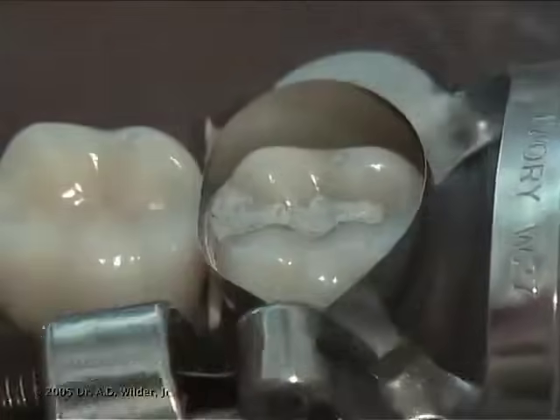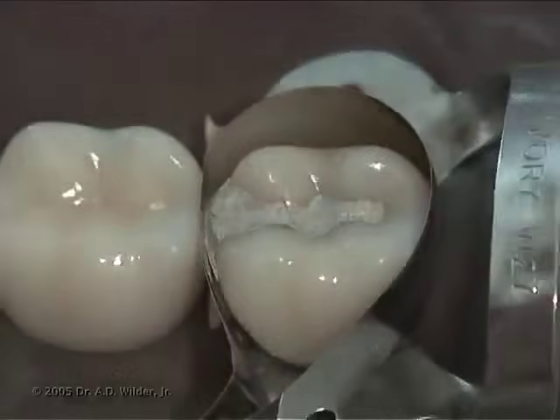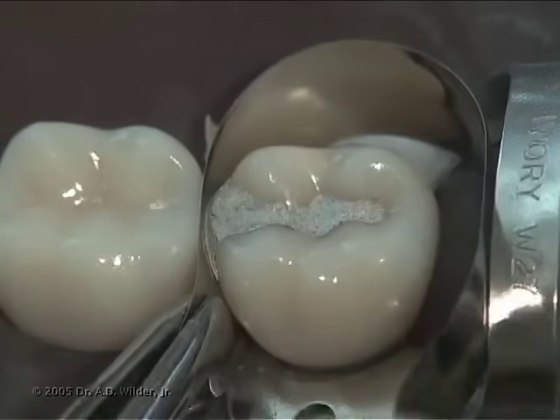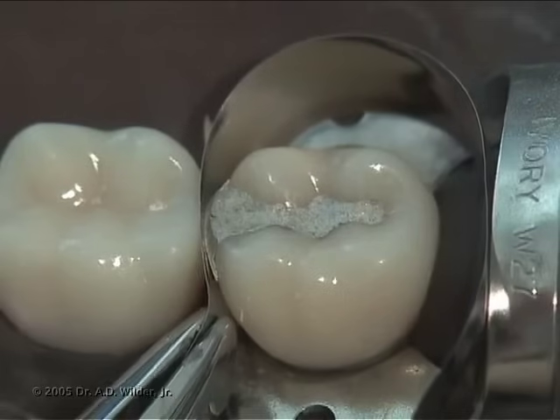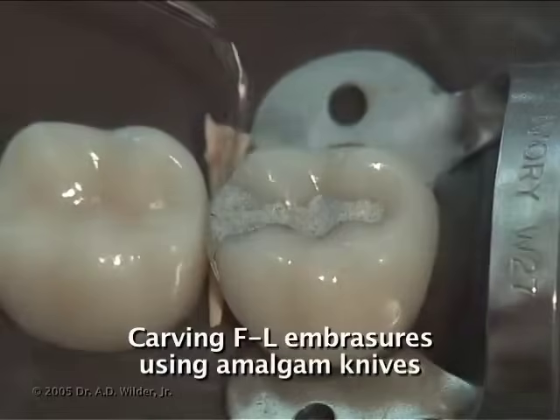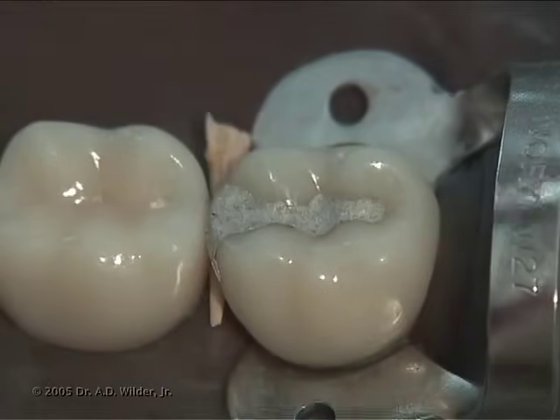After loosening the outer knob of the retainer, detach the retainer from the matrix band. Then with a hemostat or pliers, carefully pull up on the matrix band to slide it out from each proximal contact. Using an amalgam knife, you can carve the facial and lingual embrasures and adjust the occlusal embrasure as needed.